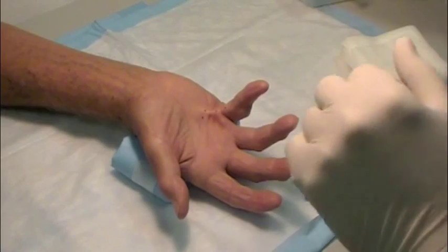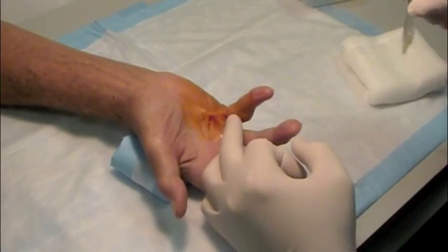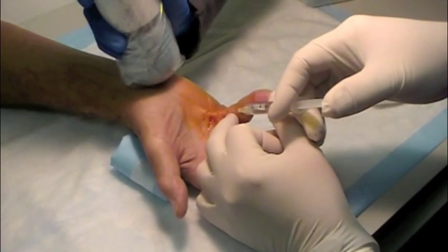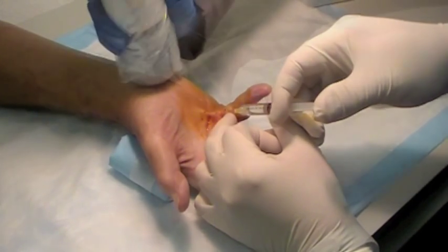The hand is cleansed with betadine, an iodine-based antiseptic. Lidocaine, a local anesthetic, is injected to numb the skin. Vibration is applied to the wrist to ease the discomfort of the injection.